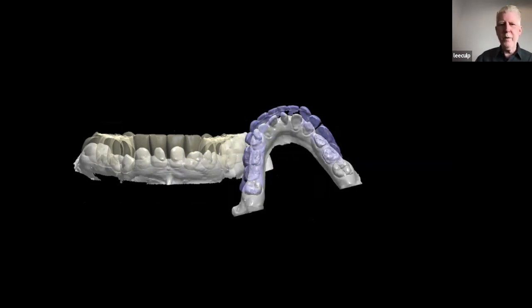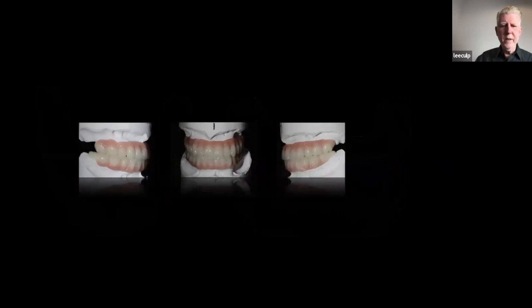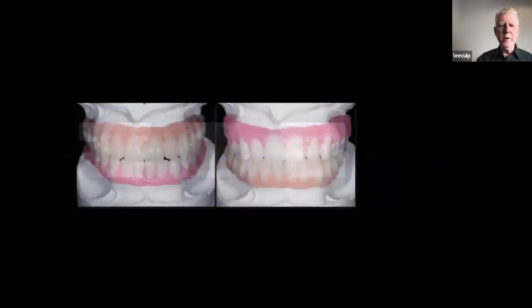And when we got it to where we wanted, we did cut to tissue, which eliminated everything from the bottom, which gave us our denture fit. We did then add composites to the facial for tissue. And it looks like this. So this is ours. It's actually a comparison of what he did to what we milled and how close we were able to get to his original design. So that's upper acrylic to lower wax on one side, upper wax to lower acrylic on the other side.